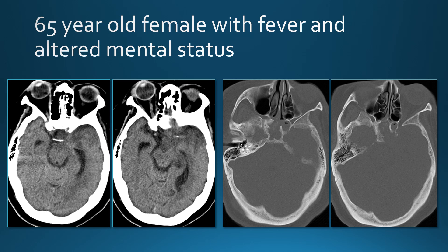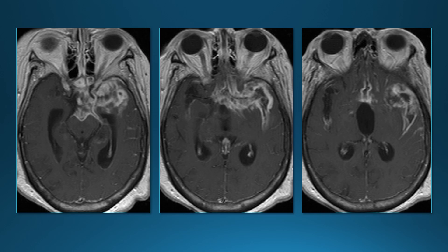First case: a 65-year-old woman with fever and altered mental status. On CT, the first thing we see is that the suprasellar cistern does not have normal density — it seems higher density than CSF. On bone windows, the sphenoid sinus is opacified and if we look carefully, the bone is eroded along the margin between the sphenoid sinus and the brain, potentially allowing infection to spread to the intracranial compartment. On MRI, we see leptomeningeal enhancement along the midbrain and the sylvian fissure, with some enhancement in the suprasellar cistern and probably also in the adjacent brain parenchyma.